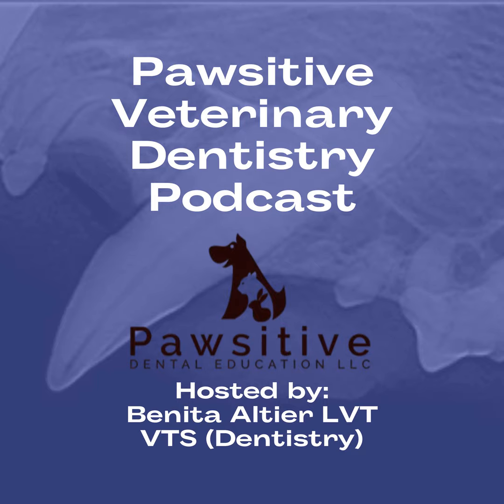cats that don't have evidence of periodontal disease or endodontic disease, or cats that have radiographic evidence of an intact periodontal ligament. You can't have those. You can't do the crown amputations, or you shouldn't do the crown amputations. With that, crown amputations are obviously way easier than having to dig those tiny little fragile glass-like tooth roots out of there. So it would be much easier to just crown amputate everything. But the problem is if you don't have those criteria, you're not necessarily doing right by that animal to leave those structures in there.